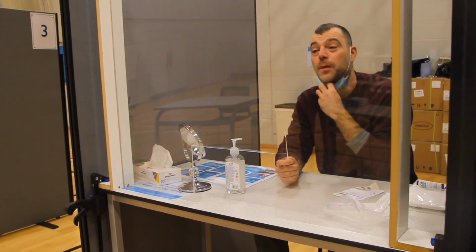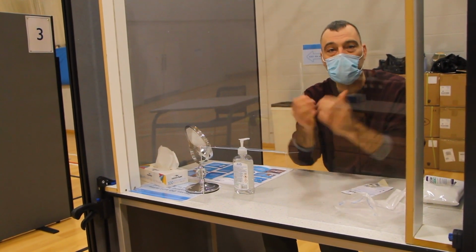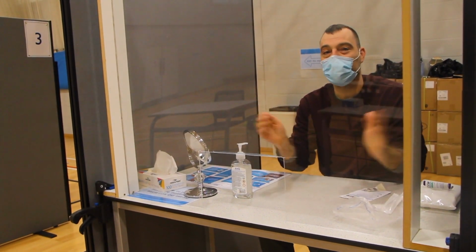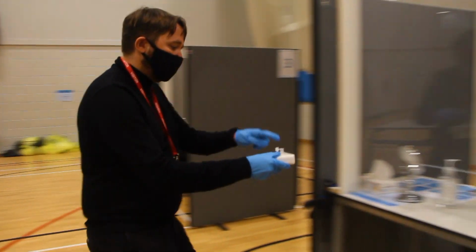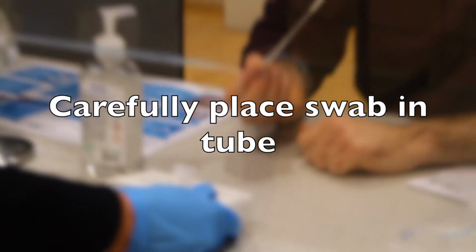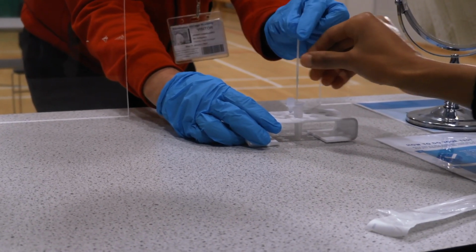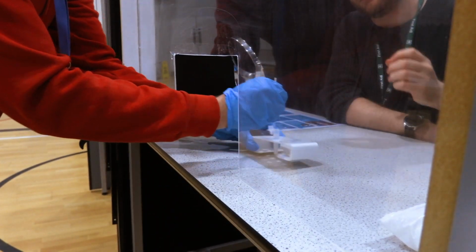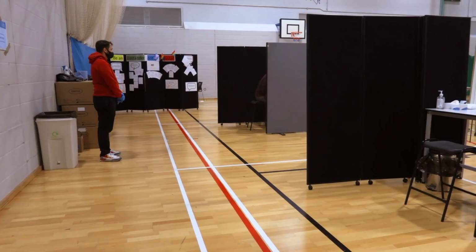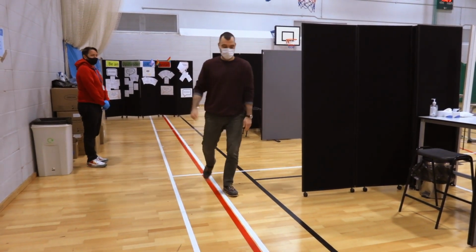Okay, I finished, so my mask goes back on, and now I have to put it inside the test tube. That's so important. Having gone through all of that, then I make sure I get this next stage exactly right. Have you finished, sir? I have. There you go. You can just put it here. Come here. All right, now very carefully, so I don't touch the sides, the swab goes in there, and that will allow the test to happen. That's right. All done for you. Thank you. Thank you very much for your help today.